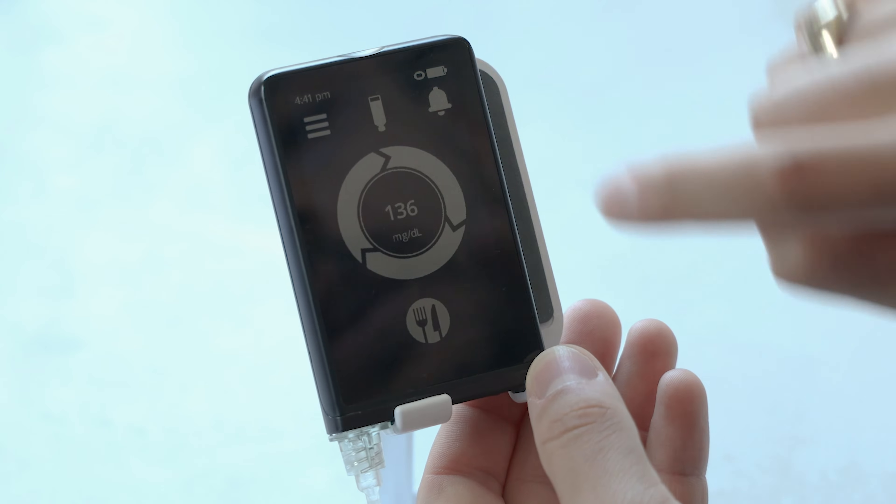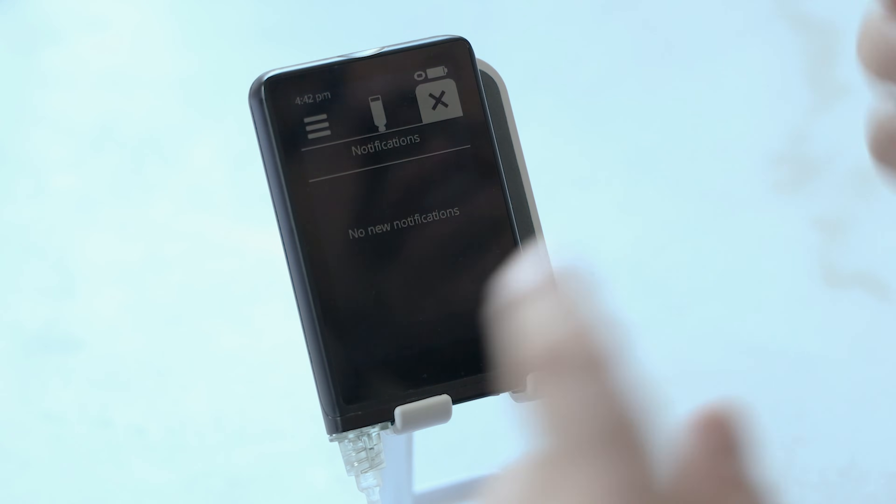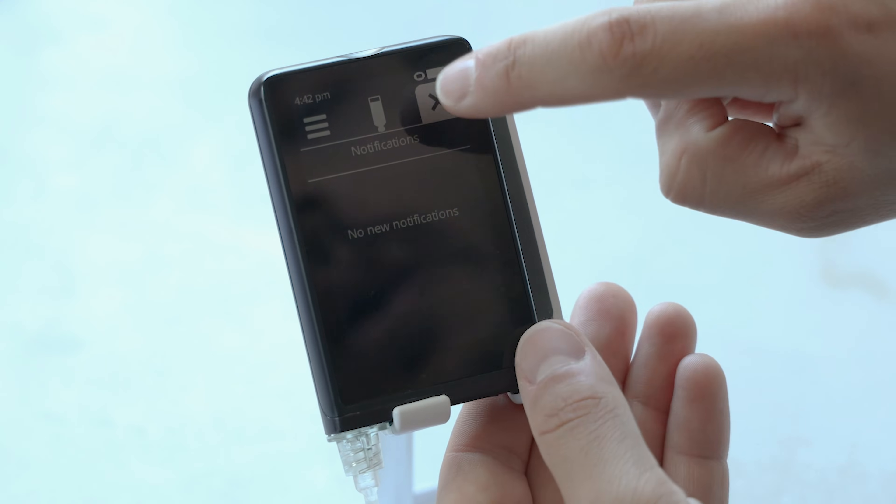I'm used to only knowing when it's 50 units or less — this one will show you pretty much from the start how many units are left in the vial. In the top right is the little bell icon. These are the notifications — if your battery's running low or other notifications, they'll show up here.